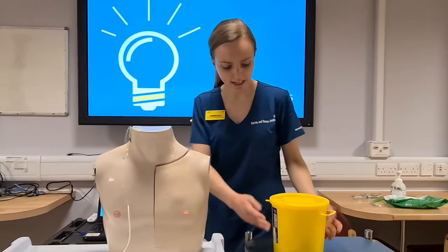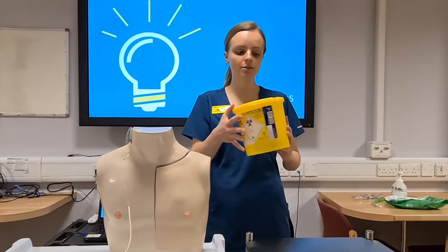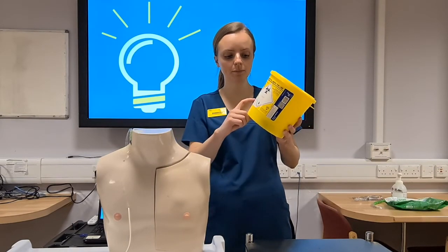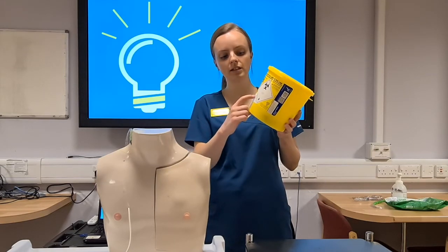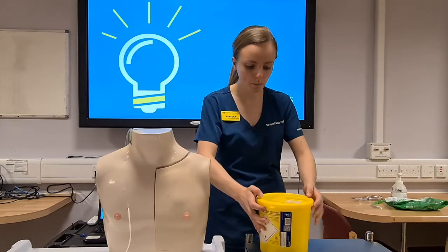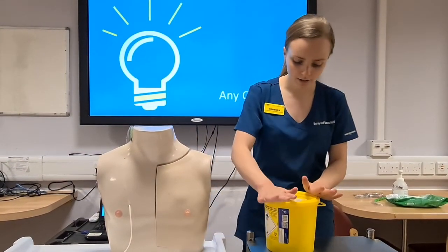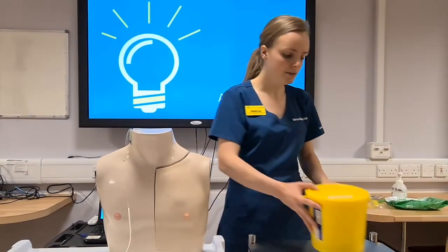Okay, just quickly at the end, sharps bins are surprisingly only for sharps. So making sure that there's no wrappers in there, there's no gloves, and that we are putting our hospital and also whereabouts in the hospital we have opened it, and making sure the sharps lid is completely firmly on. So placing it down, clicking it in place, and that the lid is fully shut.